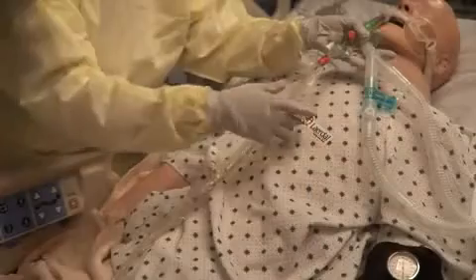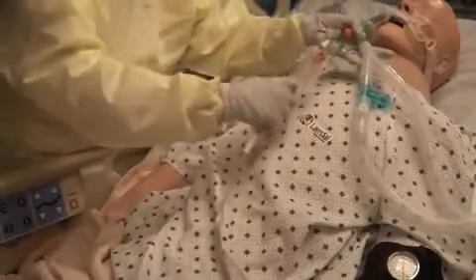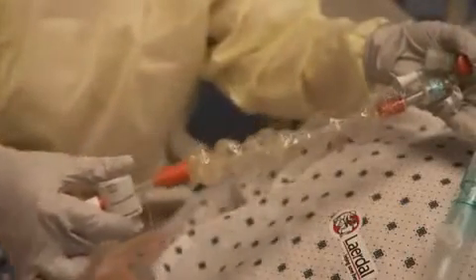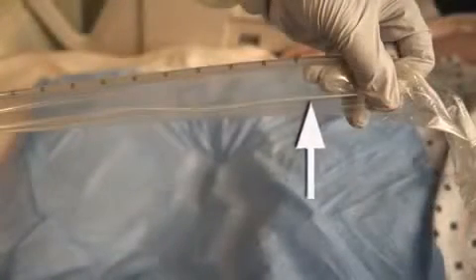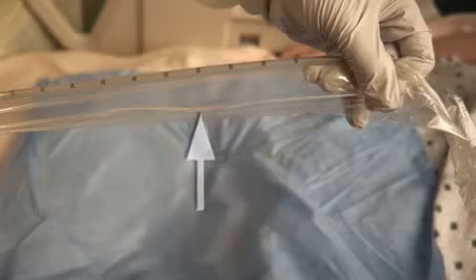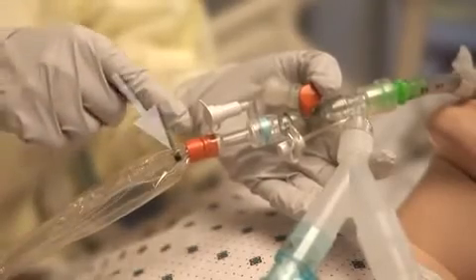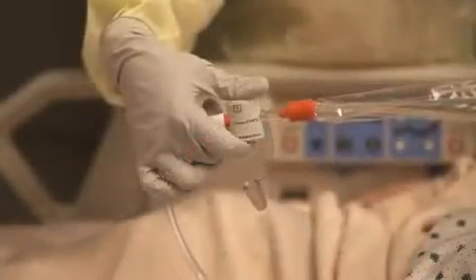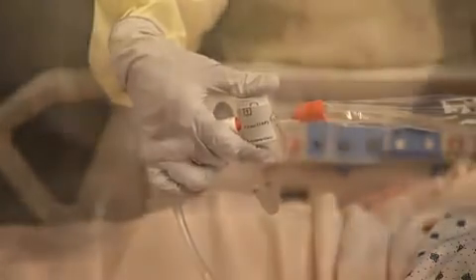Advance the catheter to the desired depth in the artificial airway using your thumb and forefinger of your opposite hand. Depress and hold the thumb control valve, then gently withdraw the catheter. The tethered sleeve, which provides a stop when retracting the catheter, therefore prevents over-retraction that leads to the inflation of the sleeve. Stop withdrawal when the black marking ring is visible inside the sleeve. Release the thumb control valve and repeat the previous steps as necessary.